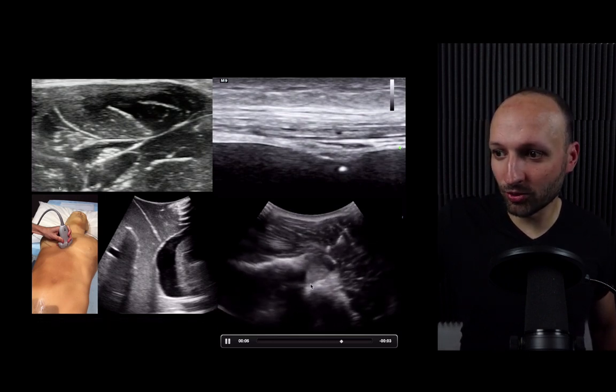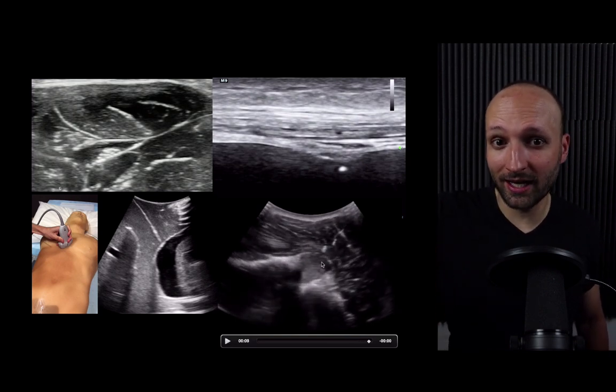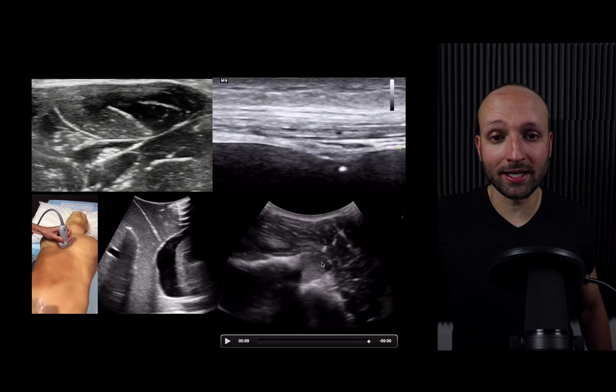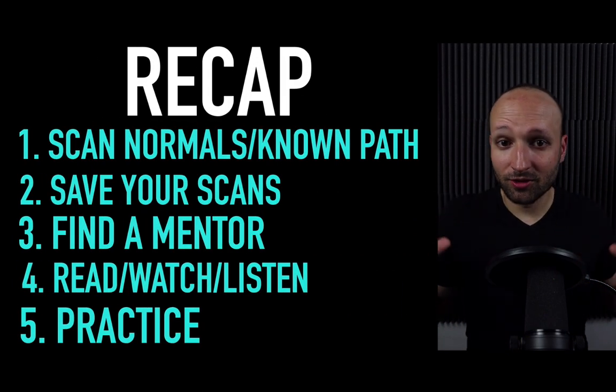This is a glenohumeral dislocation, and I was trying to take some of the clot out and then put lidocaine back in. So all of these techniques, the building block is ultrasound guided IVs. There's a lot of stuff.